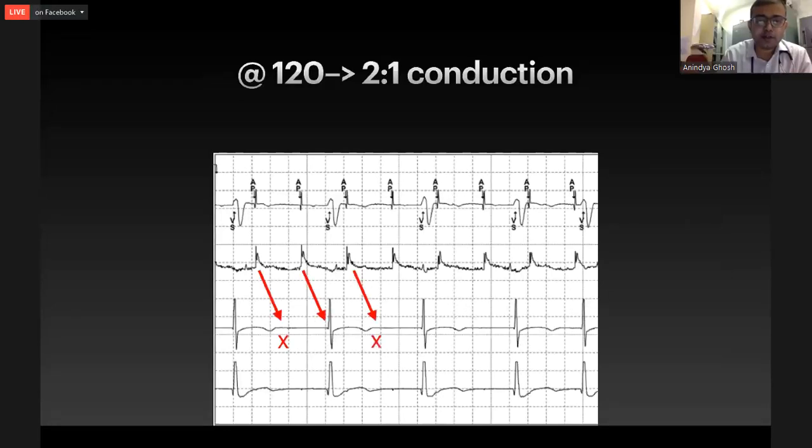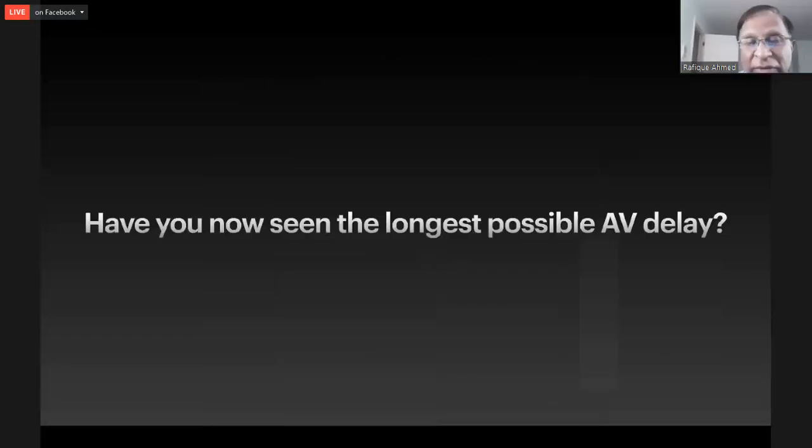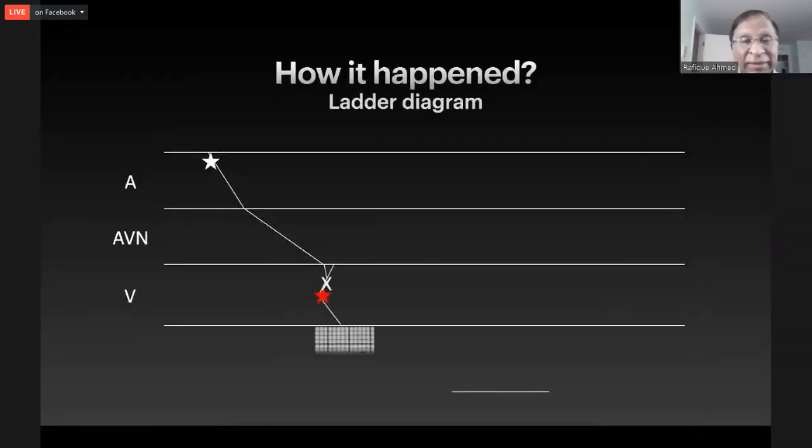Whenever we paced, the QRS rate was driven by the atrial pacing rate. Yes, absolutely. So it's not complete heart block anymore. It's probably intermittent AV block. Thank you.